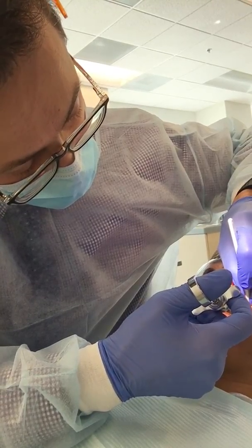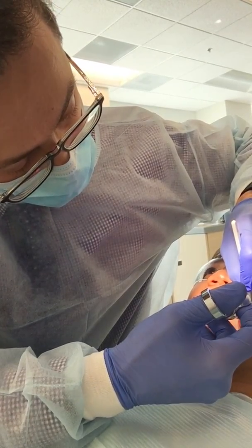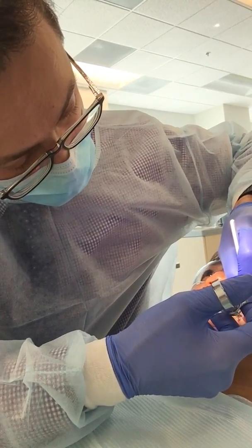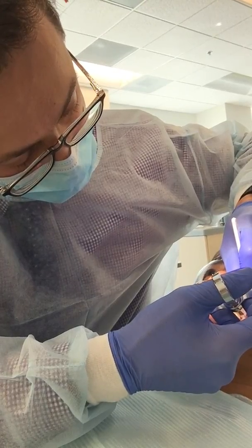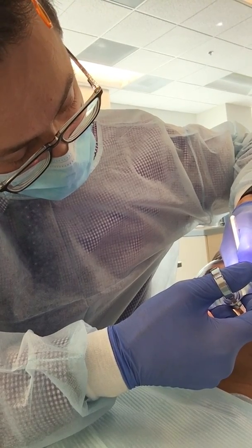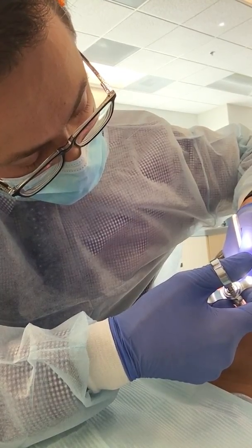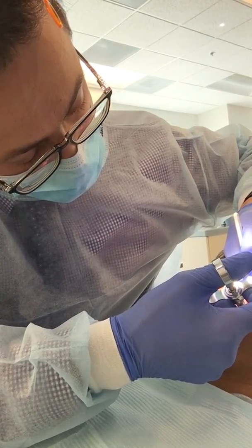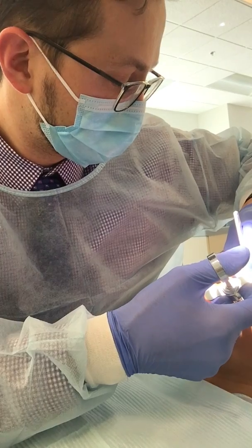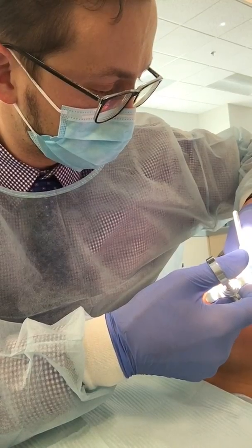Go in a couple millimeters and then change so you're out 45. Like this? Keep going in. And you're moving towards me at 45. There you go, right there. Keep going all the way down until there's about three millimeters. A little bit more — right about there. Aspirate. You gotta aspirate. Looks good, go ahead. And then just make sure you don't pull out as you eject. That's the one people have to watch a lot.